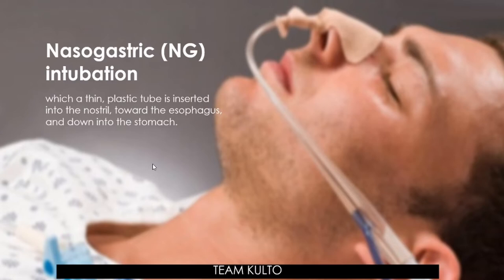The technique is often used to deliver food and medicine to a patient when they are unable to eat or swallow. Isa sa mga indication niya is kapag may mga dysphagia or inability of the patient to swallow or to eat, okay? Now, NG tubes are usually short and are used mostly for suctioning stomach contents and secretions. Okay, let's have the indication.